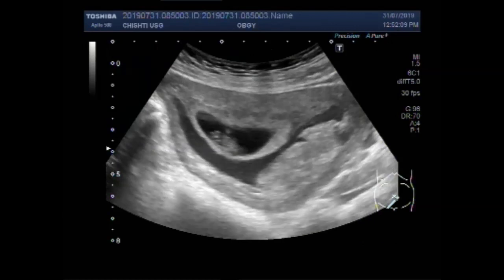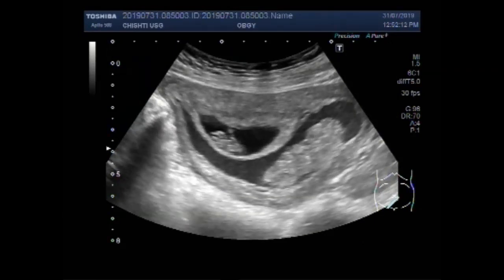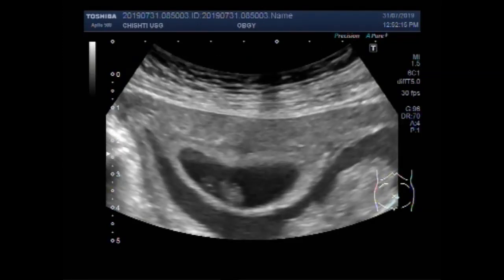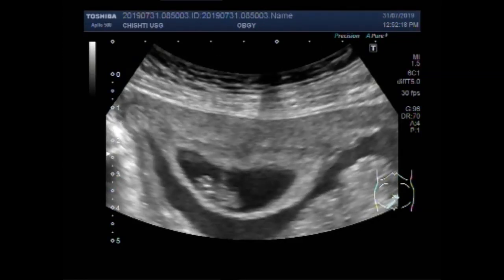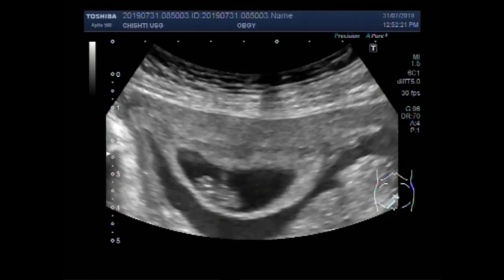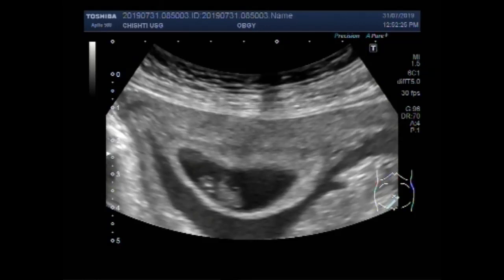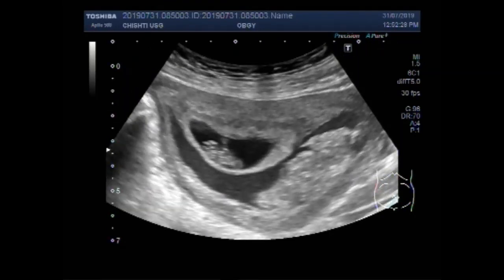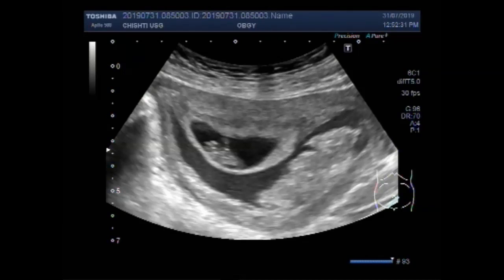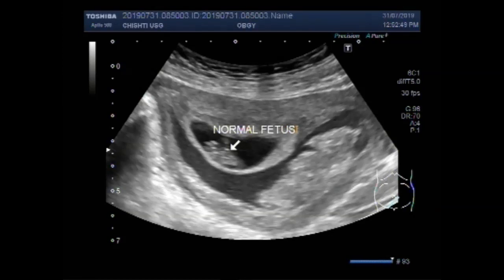The one gestational sac has a fetus with fetal demise, while the other gestational sac has a viable, alive fetus. The cardiac activity is visible. The gestational age of this fetus is about 8 weeks and 2 to 4 days.